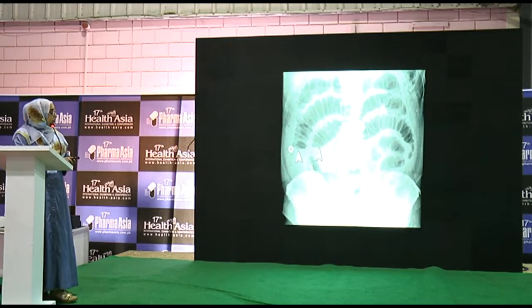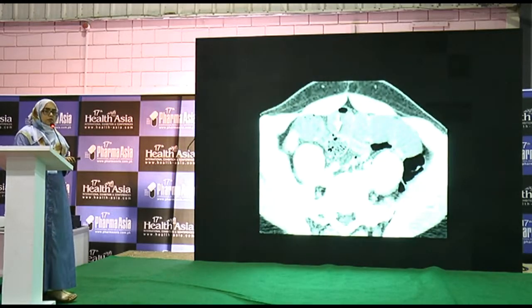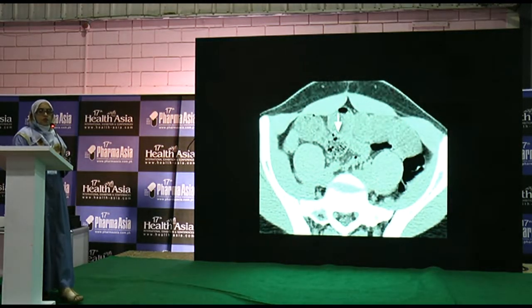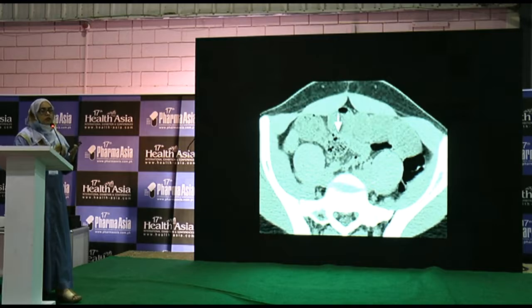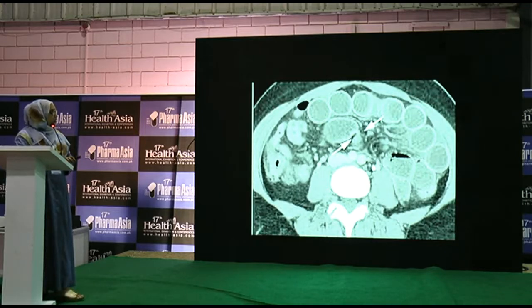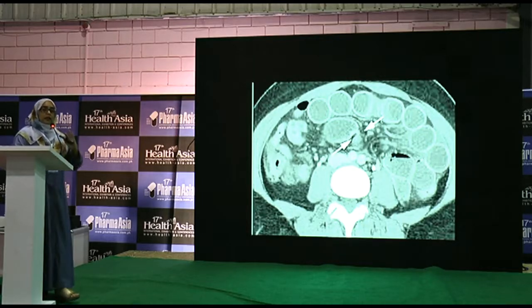After erect abdominal X-ray showing dilated small bowel loops and air-fluid levels, CT scan was done. CT showed dilated small bowel loops and the small bowel feces sign — if you are struggling to find the transition point, look for this sign and it will guide you. The small bowel obstruction could be due to adhesions, strictures, or masses. In one adhesion case, the arrows point toward the adhesion; always look for the point of transition — the change in calibre from dilated to normal.